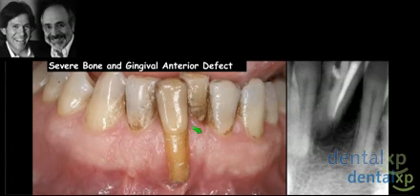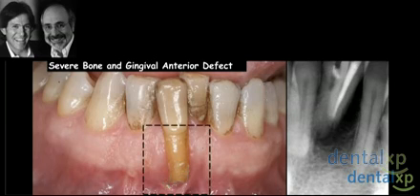So once again, we're going to be caught with a similar situation here, David, of having to replace 2 teeth in the mandibular incisor region, and here we have a severe labial deficiency of soft and hard tissues all the way down to the mucosa. There's no attached gingiva remaining. Even exacerbated because you've got even less distance between the adjacent teeth to manage.